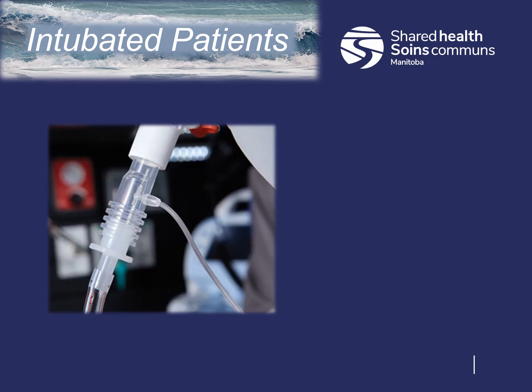With intubated patients, we need to monitor tube location. We know that end-tidal CO2 can confirm the initial BIAD placement, but continuous capnography monitoring of placement is another advantage to ensure that we are ventilating our patients appropriately. If the BIAD is properly placed, there will be an end-tidal reading after each ventilated breath. If we see a loss of waveform or changes that don't appear consistent with exhalation while we are ventilating, this could be an indication that we need to troubleshoot what is going on.